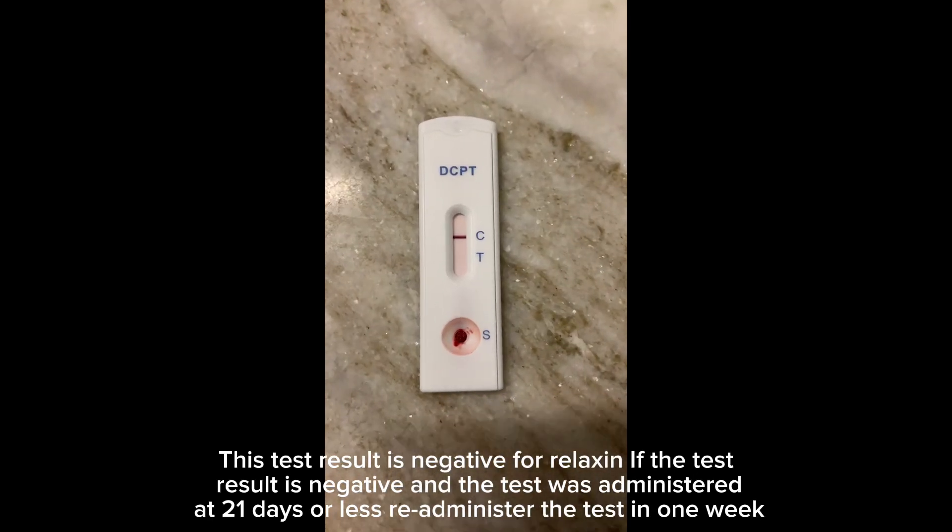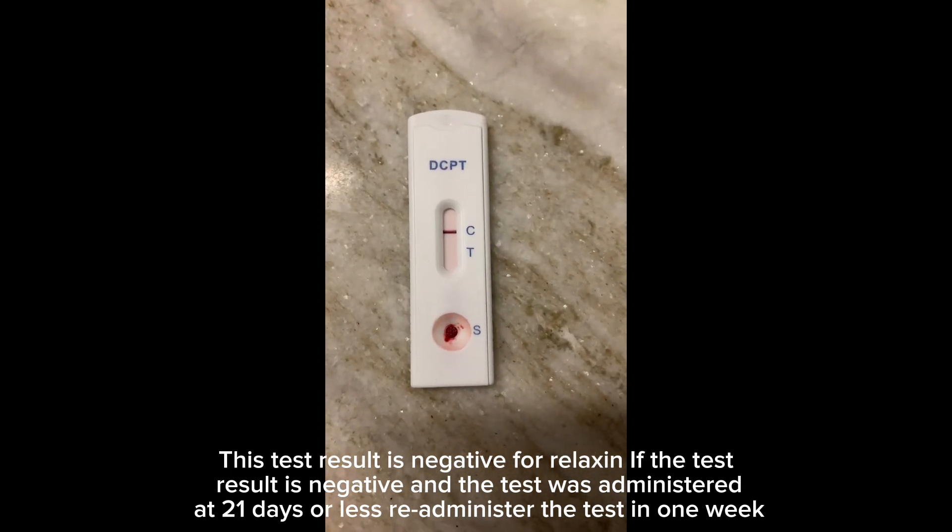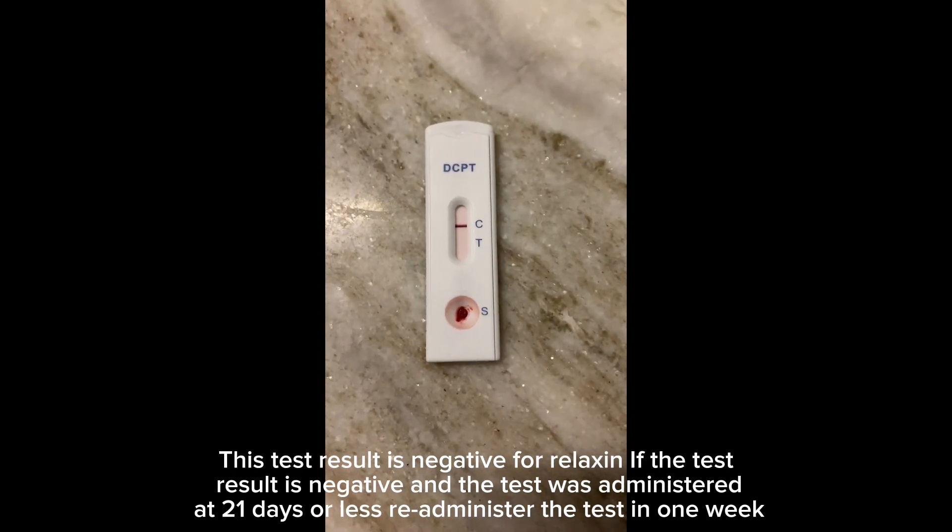This test result is negative for relaxin. If the test result is negative and the test was administered at 21 days, re-administer the test in one week.